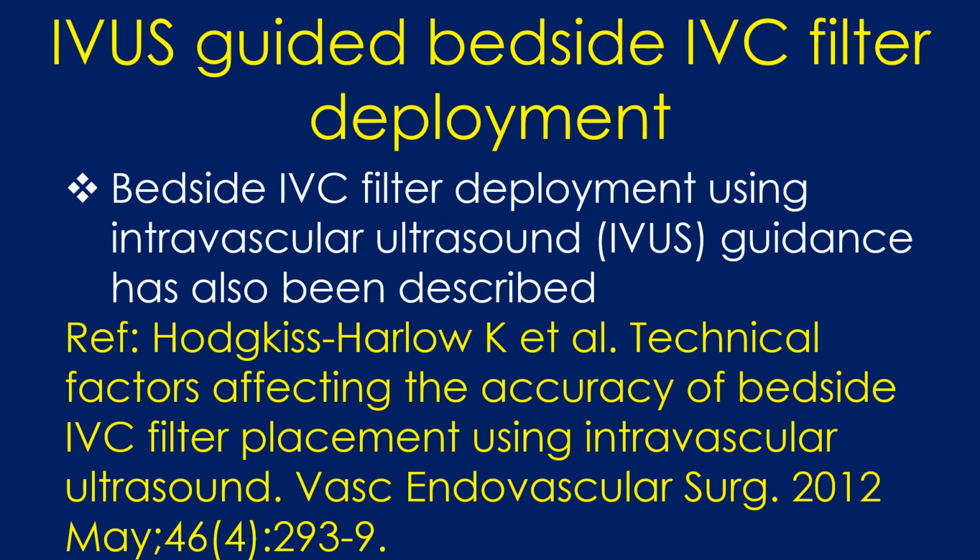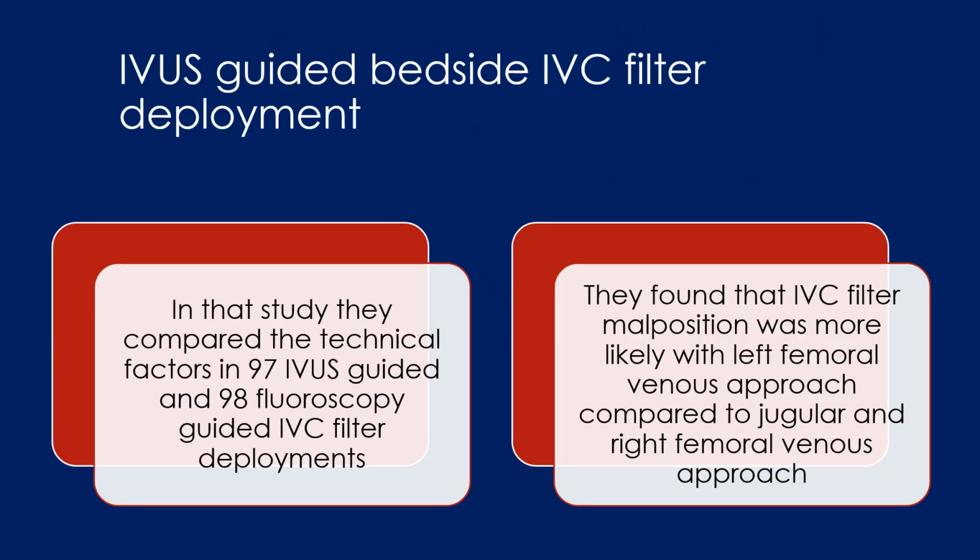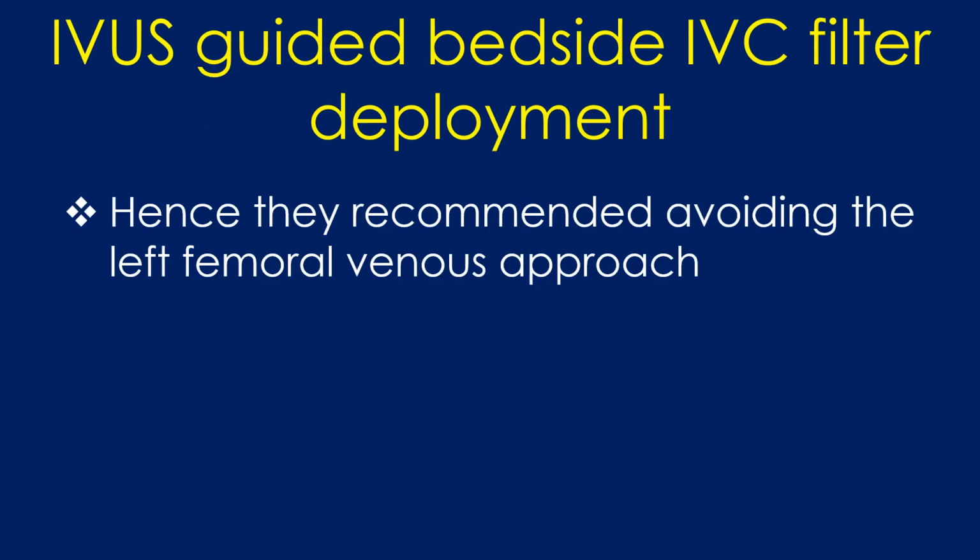Bedside IVC filter deployment using intravascular ultrasound IVUS guidance has also been described. In that study, they compared the technical factors in 97 IVUS guided and 98 fluoroscopic guided IVC filter deployments. They found that IVC filter malposition was more likely with left femoral venous approach compared to jugular and right femoral venous approach. Hence, they recommended avoiding the left femoral venous approach.